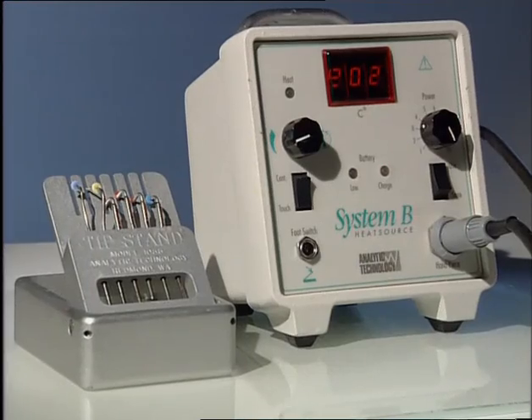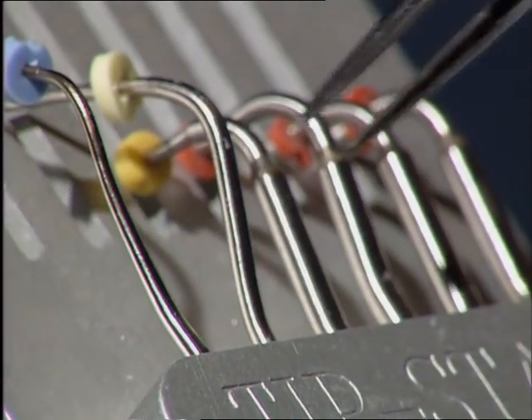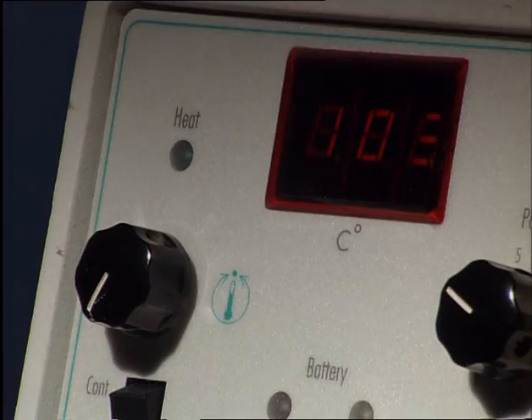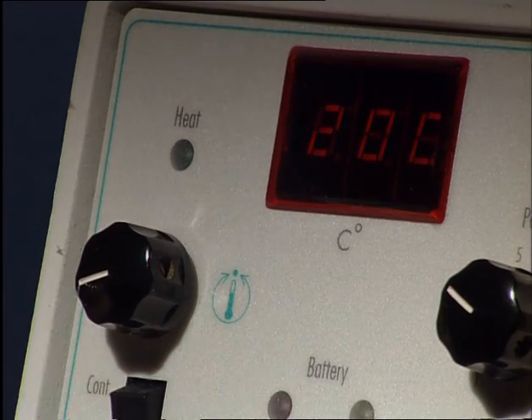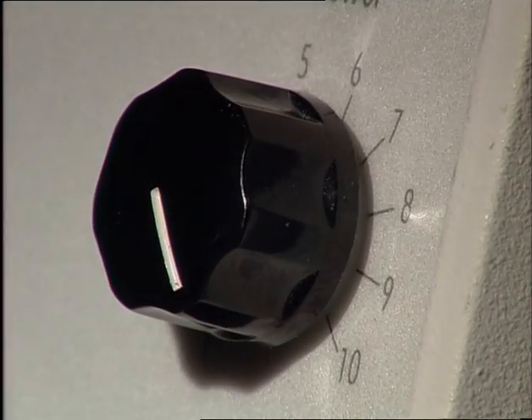An alternative to the downpacking of the classical Schilder technique was the development of the System B. With the help of the so-called Buchanan plugger, the gutta-percha is simultaneously heated and condensed. The largest plugger is selected which can be fitted to within 5 to 7 millimeters of the canal terminus without binding on unyielding dentinal walls, and the stop is adjusted. The System B heat source is placed in the touch mode and set to 200 degrees Celsius and used at full power on grade 10.